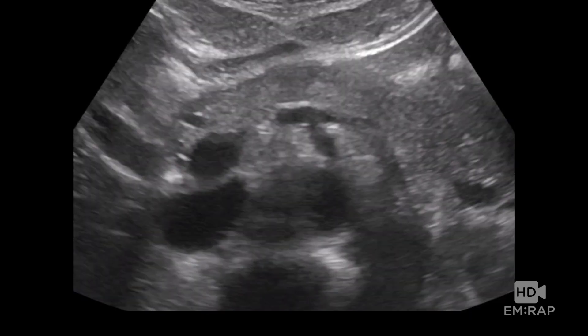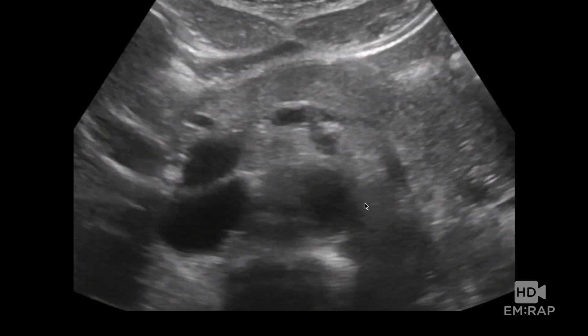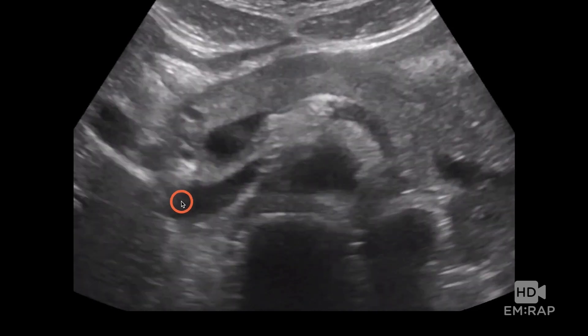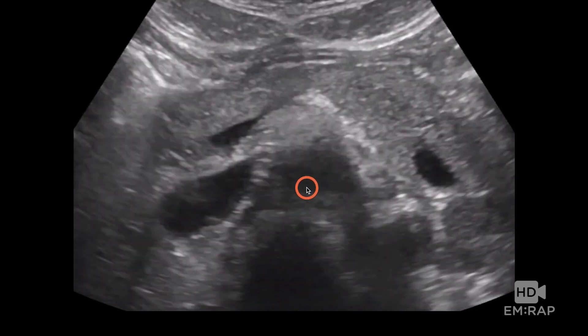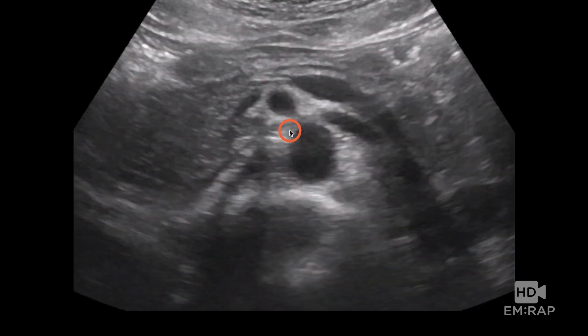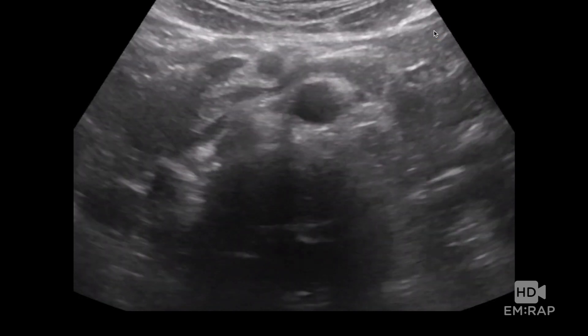An aortic dissection looks just like what you might think it would look like on ultrasound — it will look like a line in the aorta. This is the intimal flap right here. The aorta shouldn't ever have anything in it, and if you see a flap in the aorta, it's very likely to be a dissection. This is what an aorta without a dissection looks like: we have the aorta, the IVC, and the spine underneath. You just want to follow it all the way down and make sure you don't see any kind of flap in there.